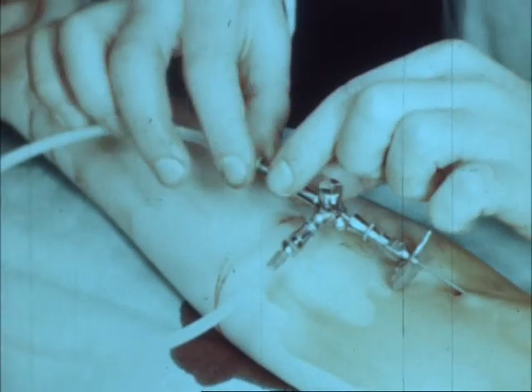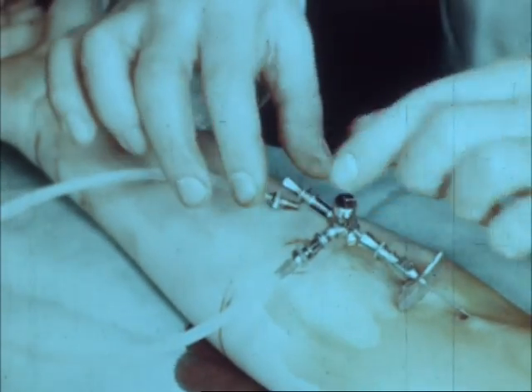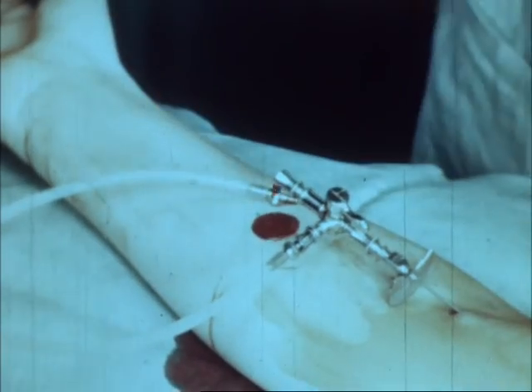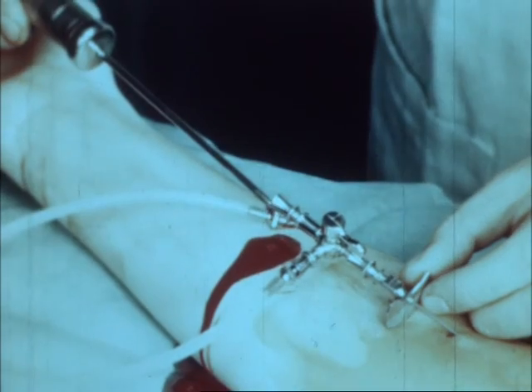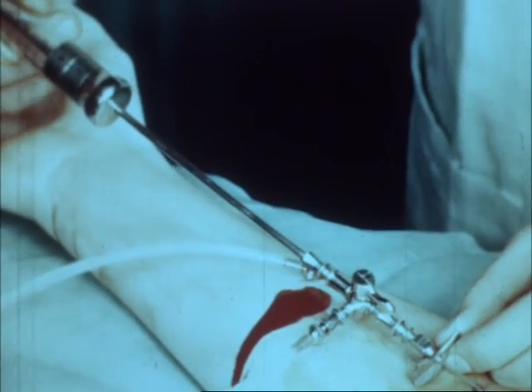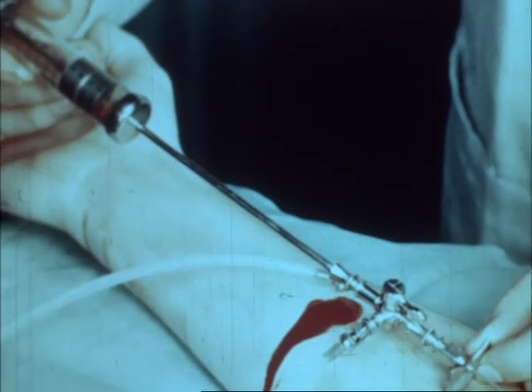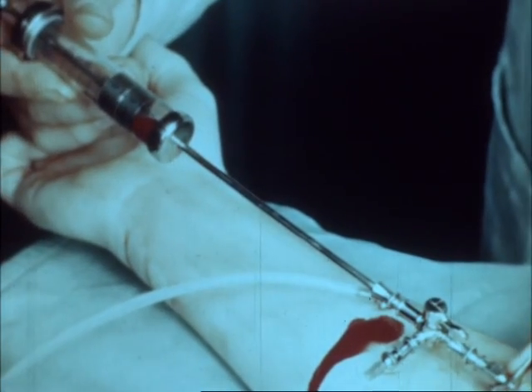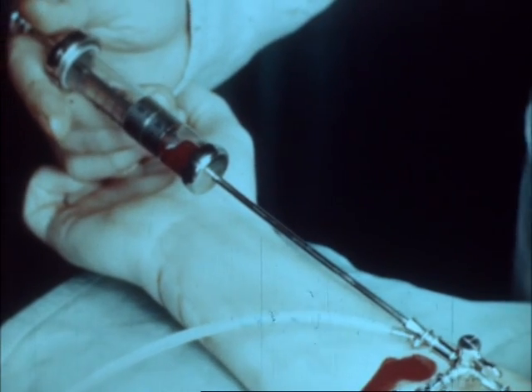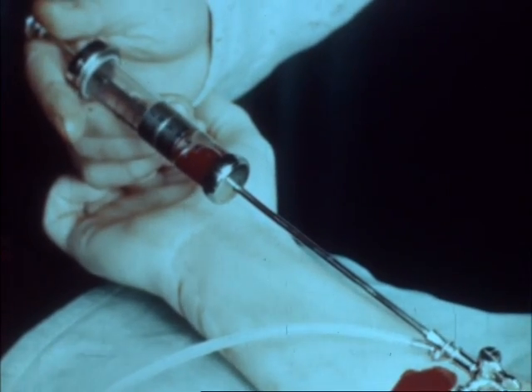An indwelling needle and stilette have meantime been inserted through the anesthetized skin into the opposite brachial artery. Simultaneously with sampling of blood from the right heart, an arterial sample is withdrawn. The blood rises into the syringe under arterial pressure, and very little traction is required on the plunger.